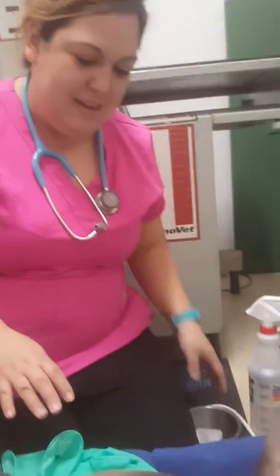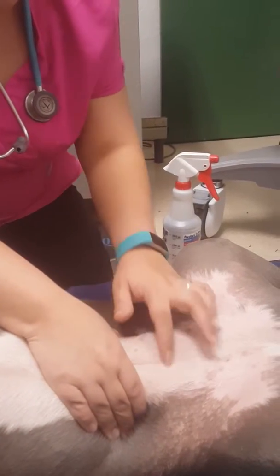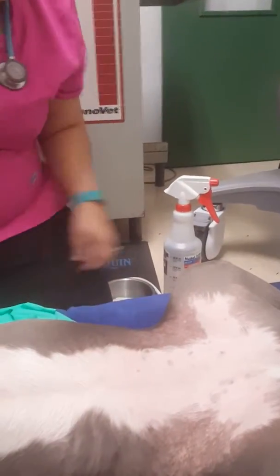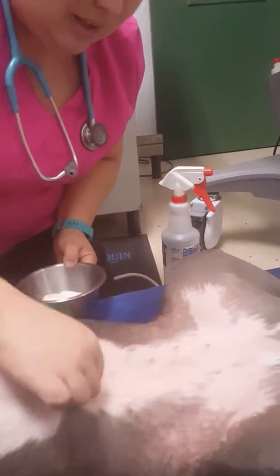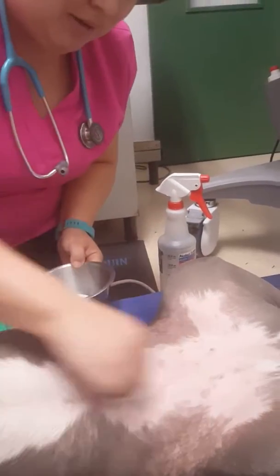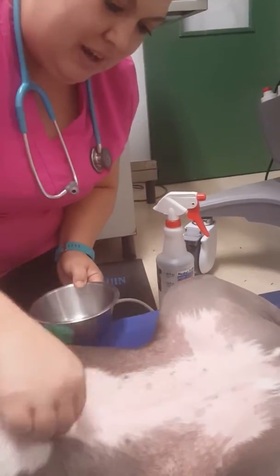We're doing a cystocentesis today. One of the main things you want to do is be able to palpate your bladder, so I'm going to go down here and make sure that's isolated. I can feel it right here — got a nice full bladder. I'm going to scrub the site and make sure it's nice and clean before we take a sterile sample. I'm using just alcohol.